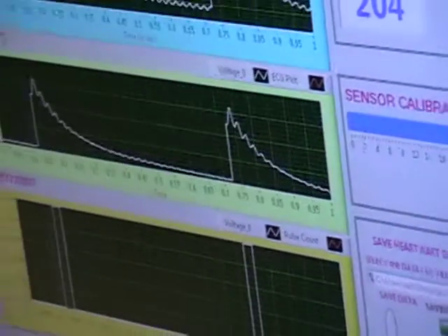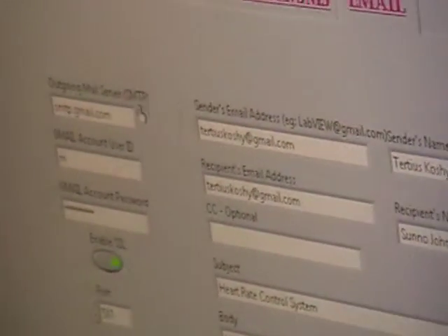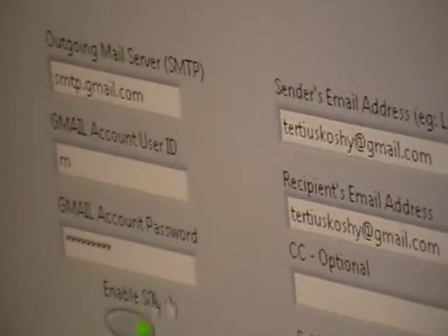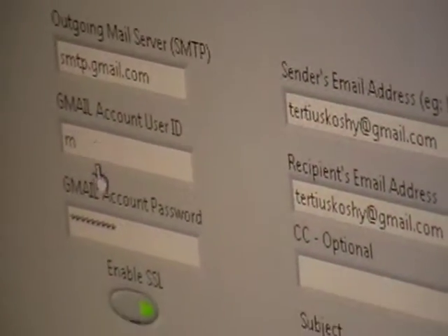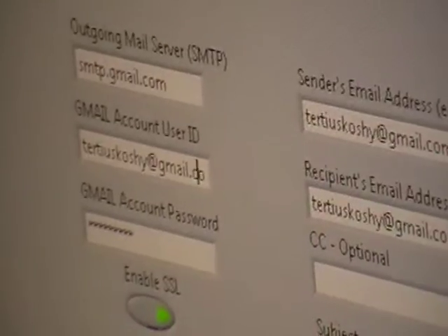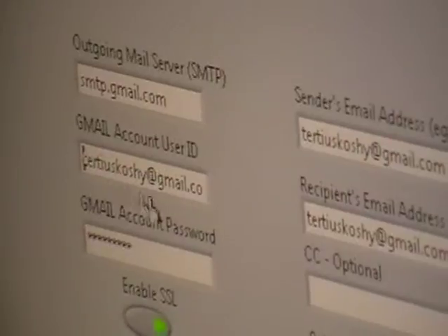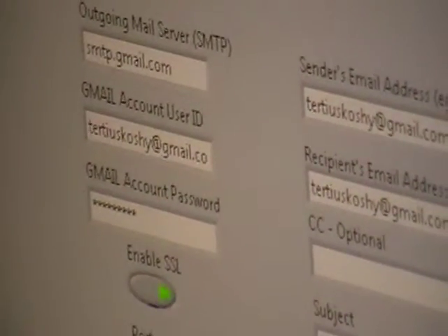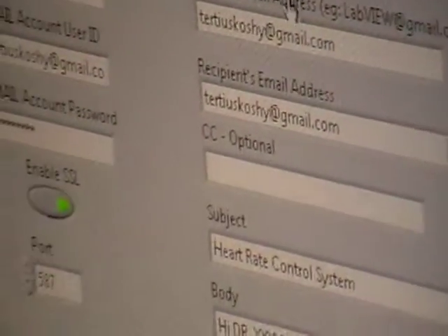So the feature template is this template. As you can see, I'm using the Gmail SMTP server for the outgoing emails. So LabVIEW has this feature to communicate with this SMTP server using a valid email ID and email account. So I have configured my email ID. I have put in my email ID. Of course, I need to give the password, and I need to enable SSL and the port that I'm going to use. I'm using port 587.